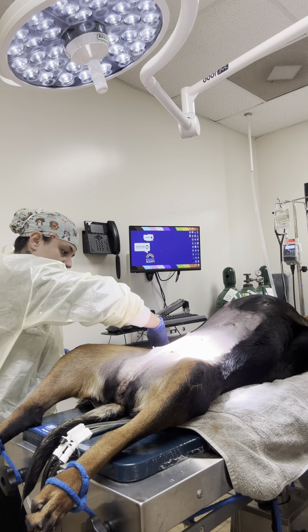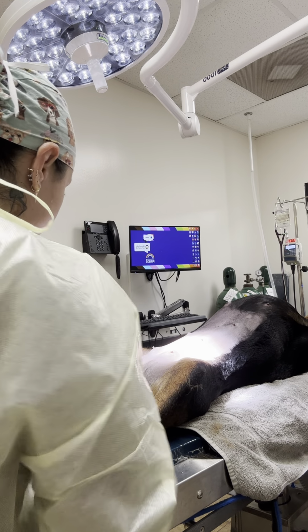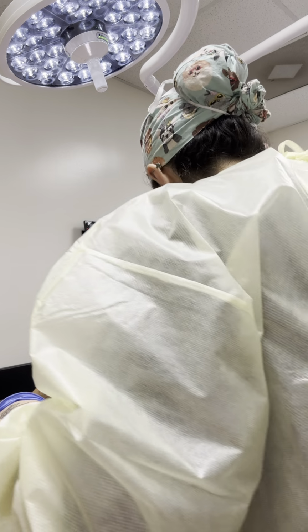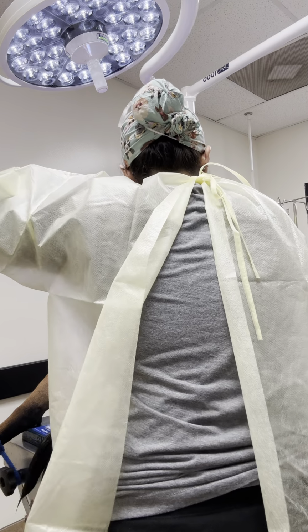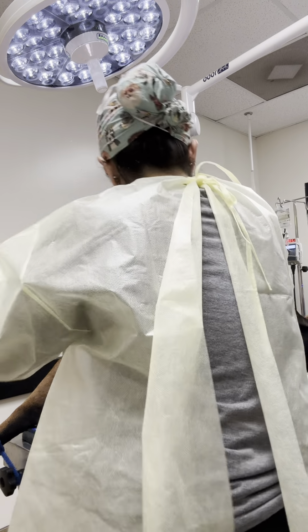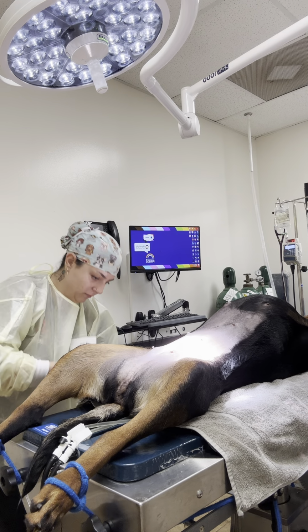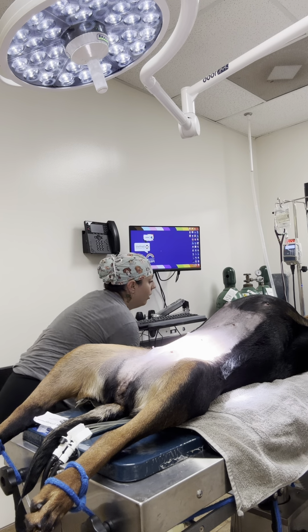Tachycardia is too fast, right? And this will slow down as we're getting good pulse off. The biggest concern is you really anticipate the tachycardia, and you go too light on this, now all of a sudden it's like 180, your dog's flailing and all that. So when I'm using my glyco, I'm doing it early, but I'm keeping it on the MAC appropriate. Okay.